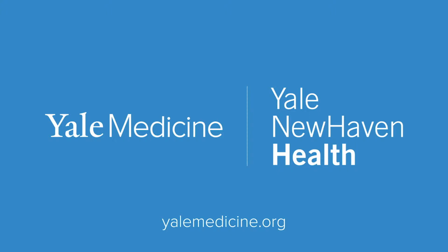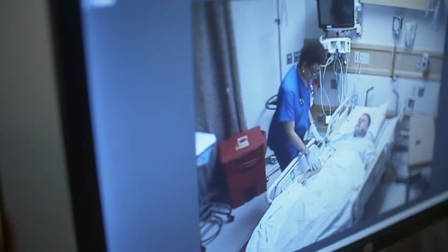The advantage of a Tele-ICU is that they simply turn on the audio-video system and they're at the patient's bedside. So we'll see how the fluid bolus works. We'll give him a few minutes. If his blood pressure doesn't respond, then we'll give him a low-dose epinephrine IV push.